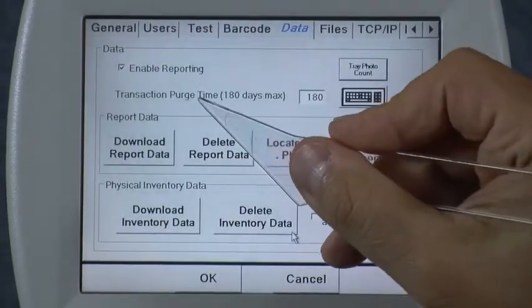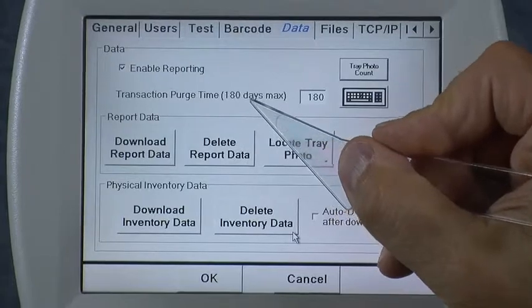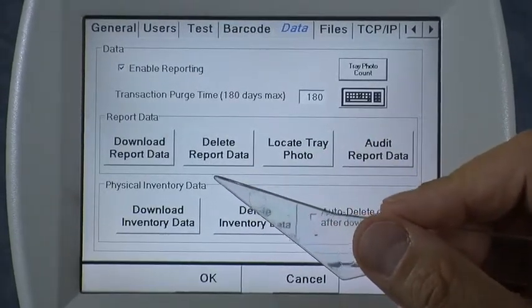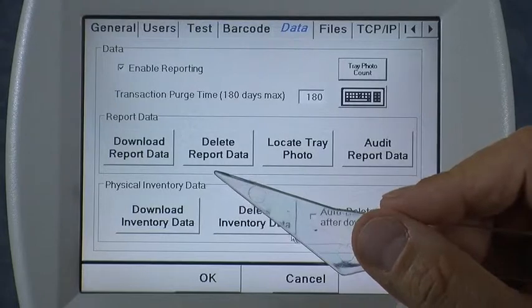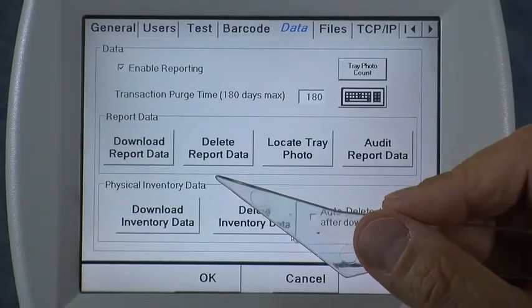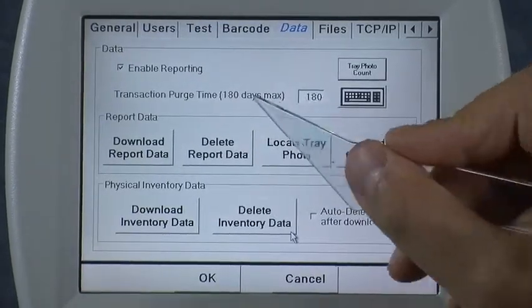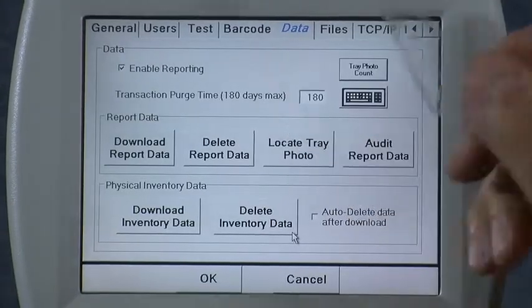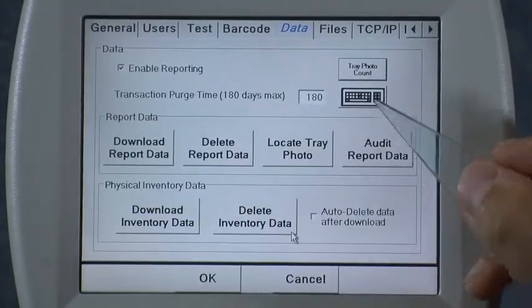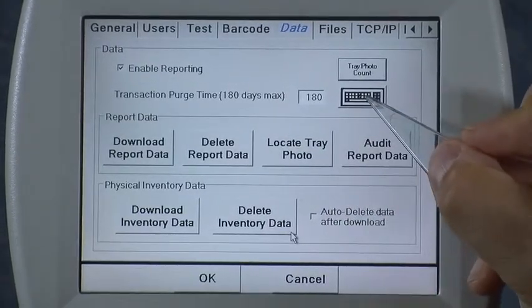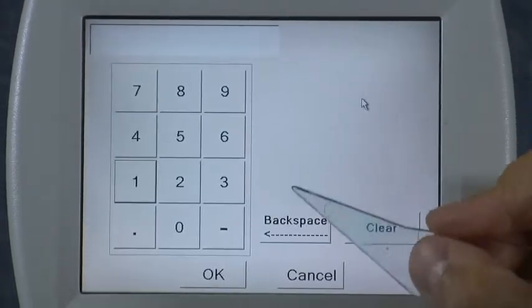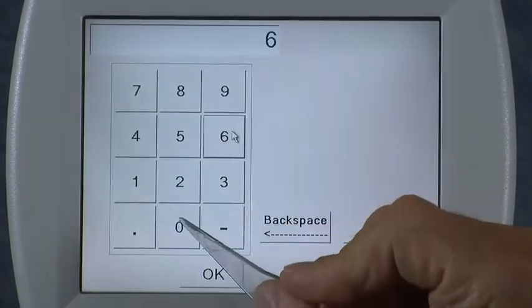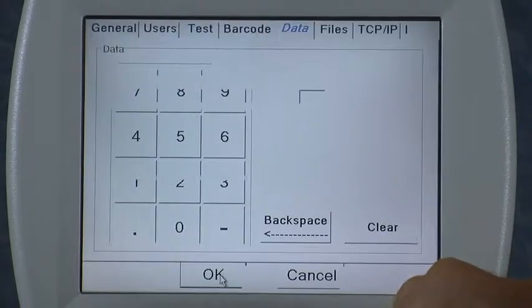The next one is the transaction purge time. This is how long the icon saves those records in the database, as well as the tray photos that are collected for every prescription filled. The default is 180 days and the maximum is 180 days. I recommend you just leave it at 180 days, but if you decide you want to change it, click the keyboard icon next to that button, key in the number of days you want to save for, and press OK.